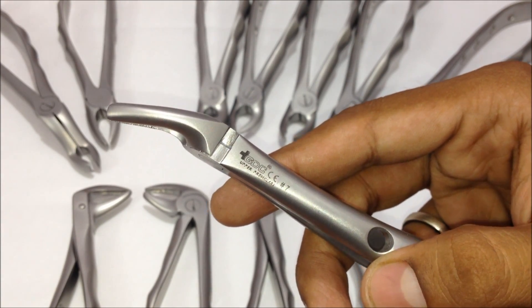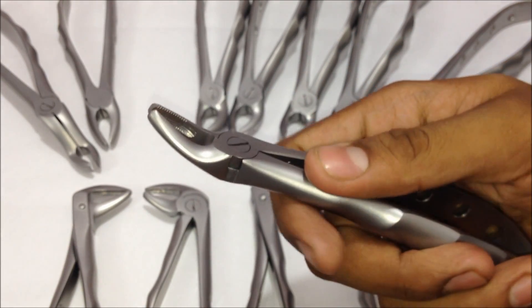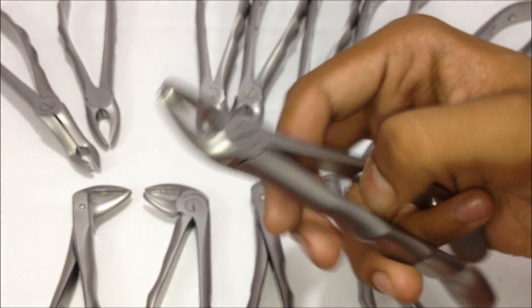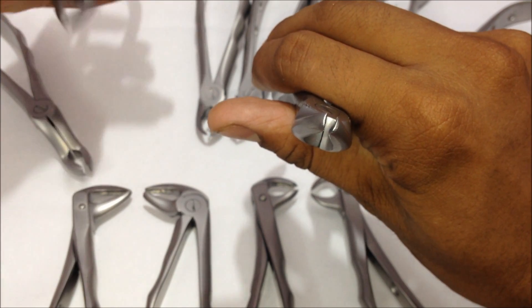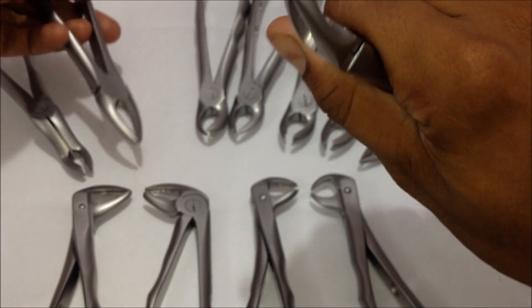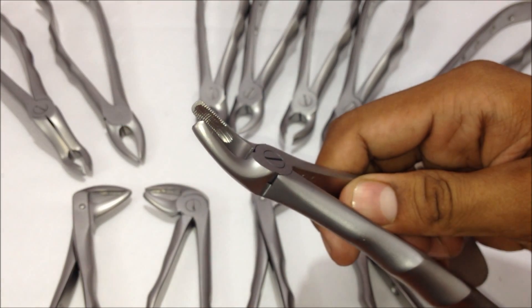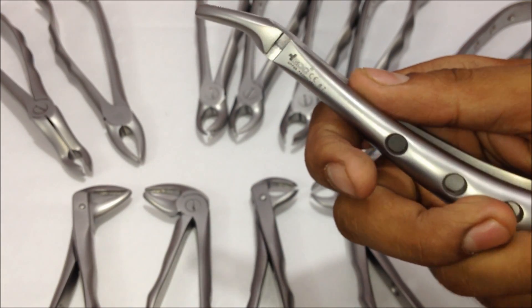This is the way you hold this forceps when the tooth is located in the upper area — you hold the premolar in this way and pull it out. It has a wider gap between the two beaks compared to the earlier forceps. This is basically for the left and right upper premolars, and has similar serrations and depression in the beak. This is the number seven forceps.